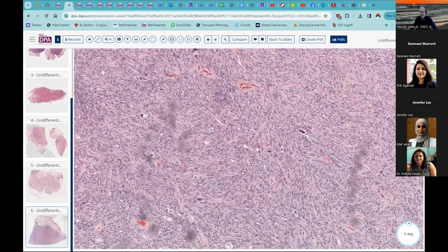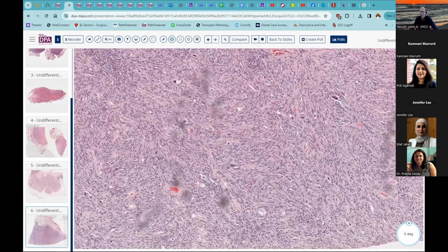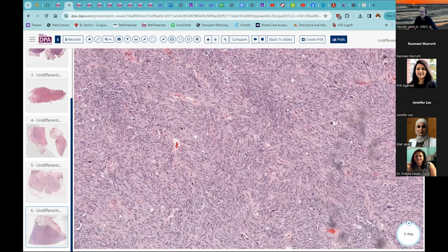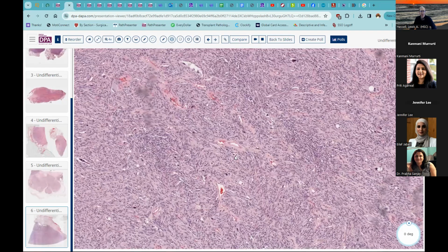You need to exclude various more specific diseases like spindle cell melanoma, anaplastic large cell lymphoma, rhabdomyosarcoma with pleomorphism, or pleomorphic leiomyosarcomas and so forth. These more specific entities are best excluded using a panel of immunohistochemistries that include melanocytic markers, epithelial markers, keratins, myogenic markers, and things like STAT6 and so forth, more specific lineage-derived markers.